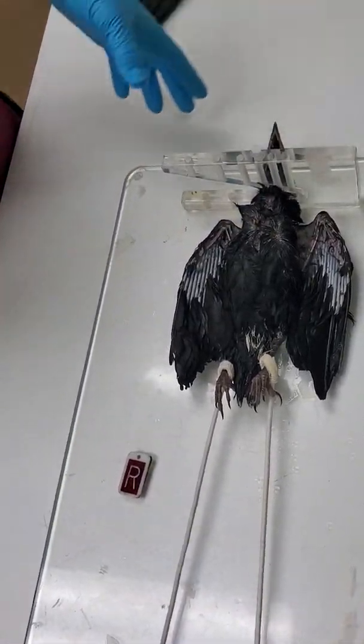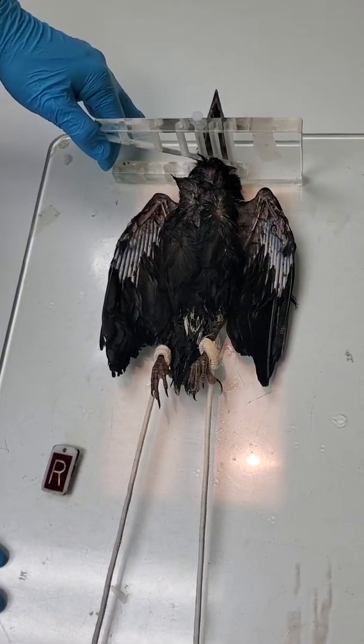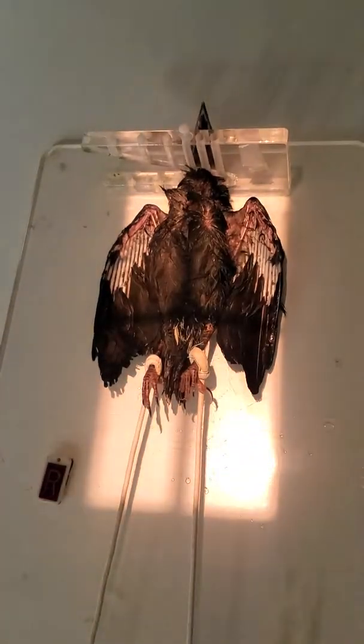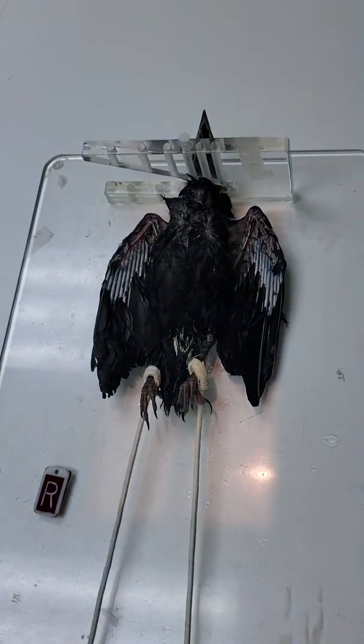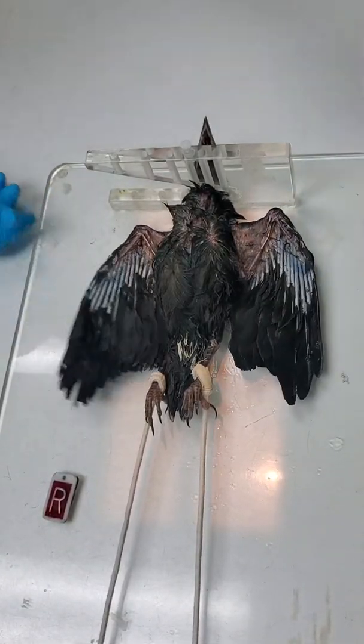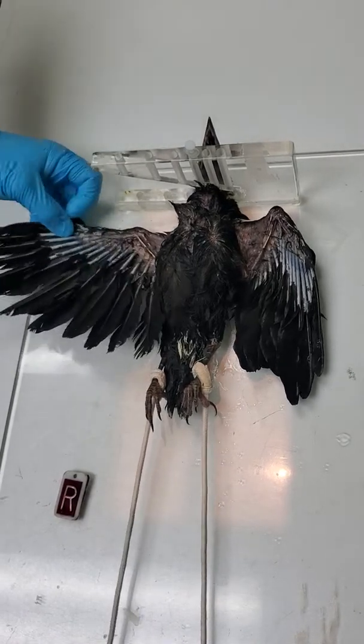If I was going to take a VD x-ray, I would adjust my collimation, which is actually pretty good if I'm not going to include the wings. I'll turn the light off so you can see how that's set up. I could either hold the wings out and take a picture, or I could tape the wings down.